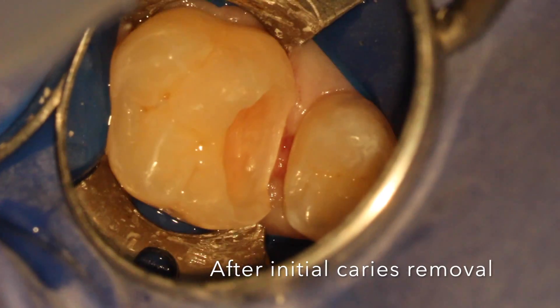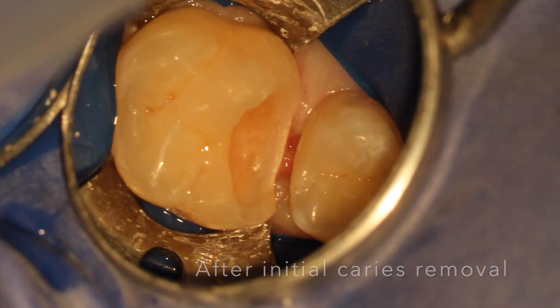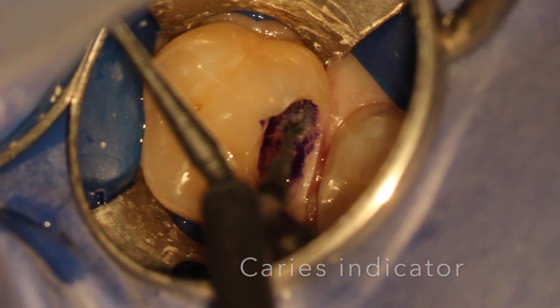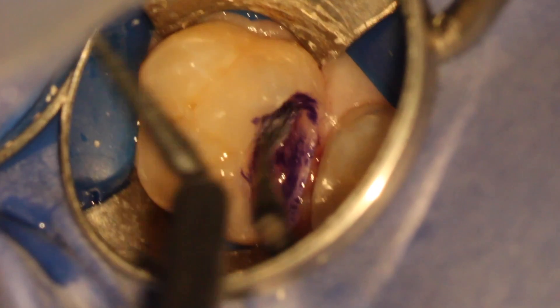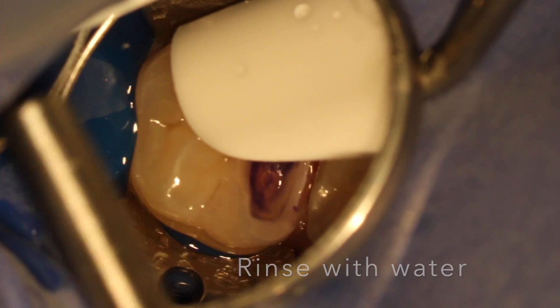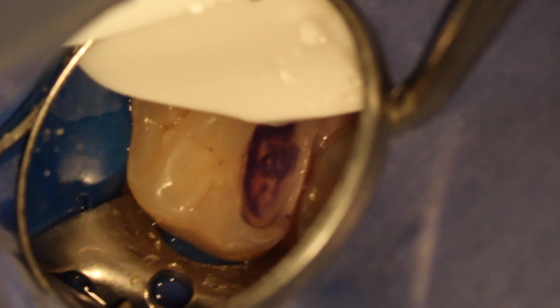Pulp testing was normal, so we did the caries removal under the microscope. You can see here, caries was initially removed, and I used caries indicator — some don't use it, but I like to use it under the microscope, especially if we're trying to look for pinpoint exposures or try to avoid them.